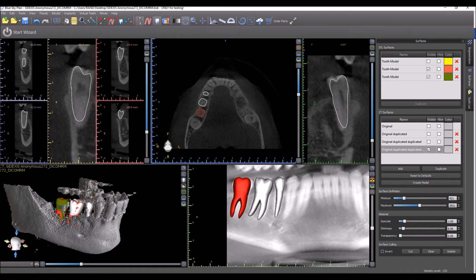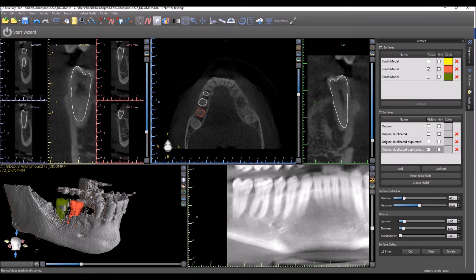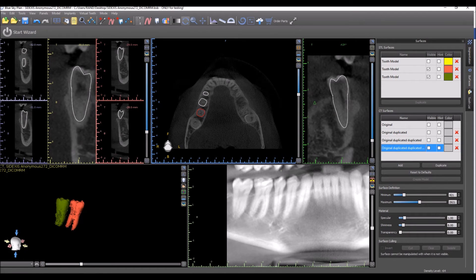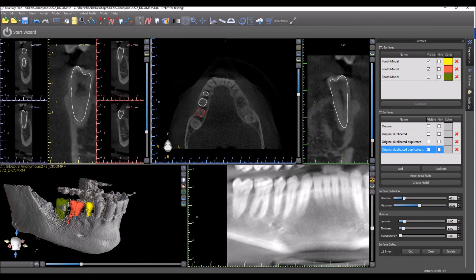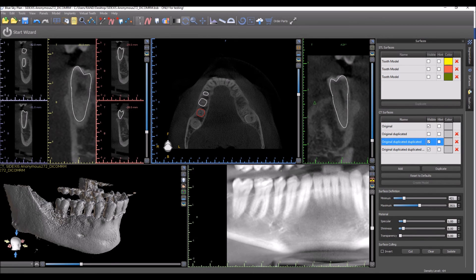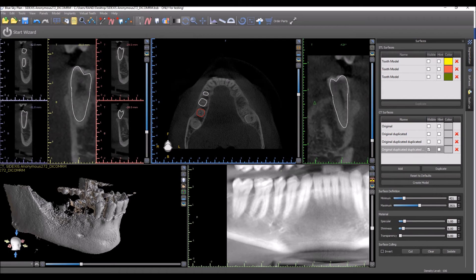The result from doing this three times is that we now have three different STL teeth. We could toggle each one on and off, or we could press the column header and make them all visible or non-visible. Each time we removed a tooth from the 3D view, we have a different CT surface with a different tooth missing. If we only want the original CT scan and the final one with the teeth extracted, we could delete the intermediate ones.